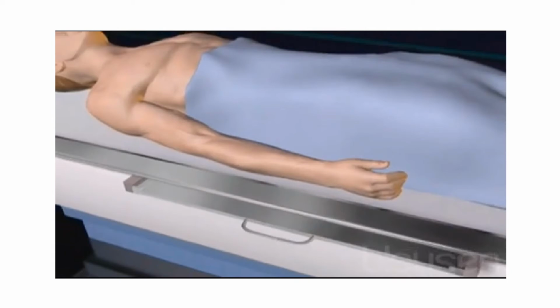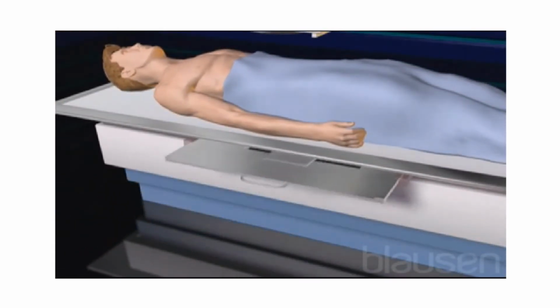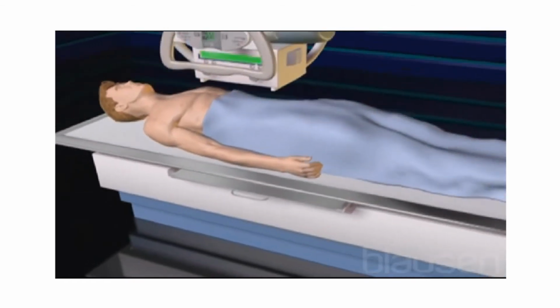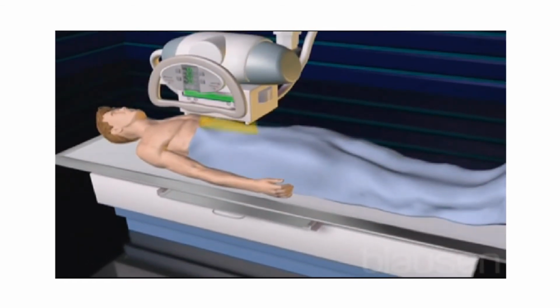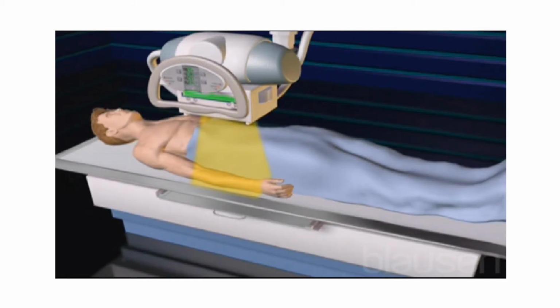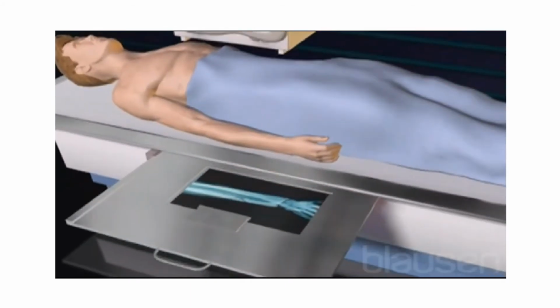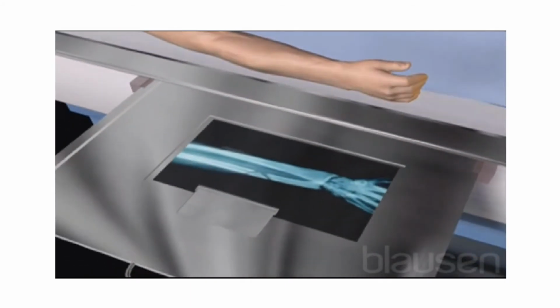This beam casts a shadow onto an X-ray film. A photograph of the internal structures is created through the shadows cast by the varying tissue densities. Softer tissue allows more X-ray light to pass through, while harder tissues, such as bone, allow less light to pass through.